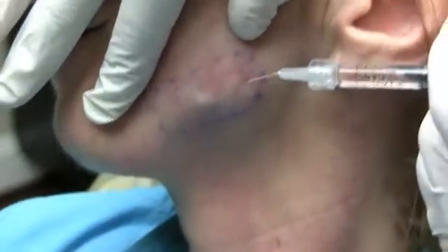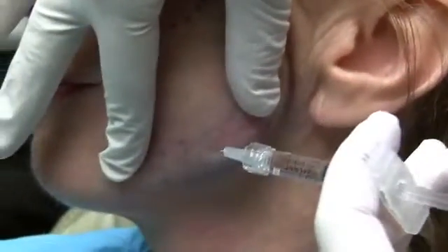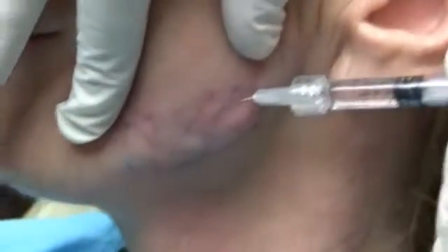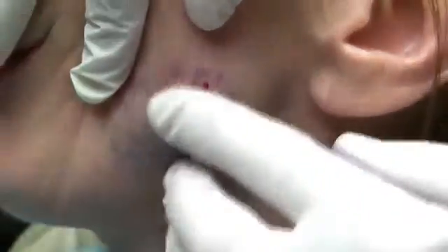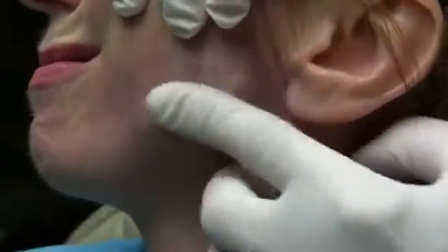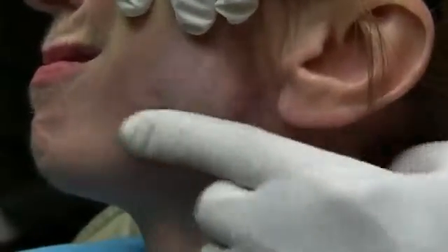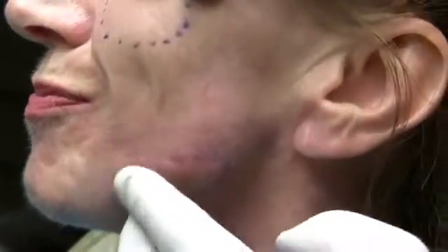Now, again, I'm going to go deeper, and I want to contour this just because of where it lies on the face. It's okay to protrude laterally. In other words, I would actually, in the final analysis, want this to stick out as opposed to just fill a void. I want some prominence here. And in the normal patient, it would be their flared mandibular border or masseter muscle that would provide that prominence.